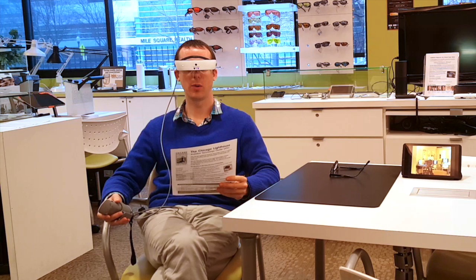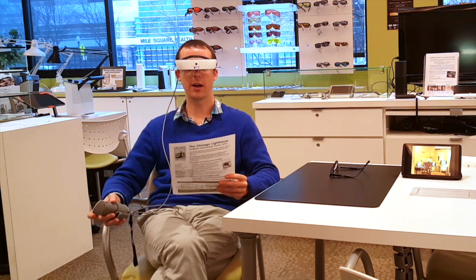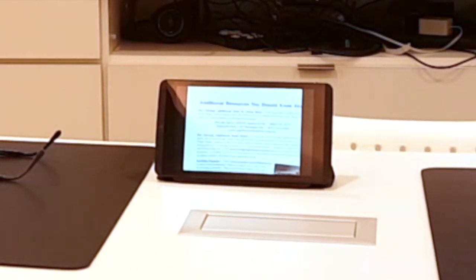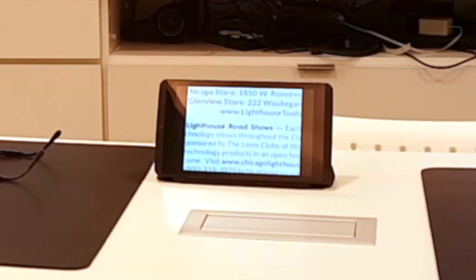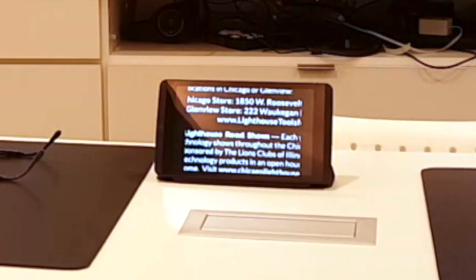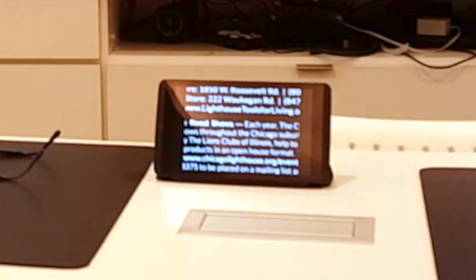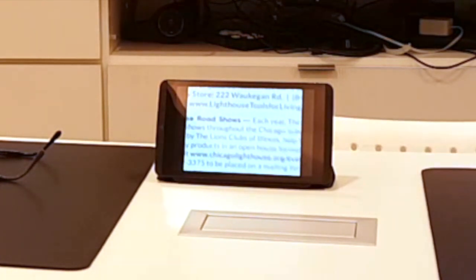Now I'm going to look at how the device fares when looking at something up close. I've got a flyer in my hand with a bunch of text on it. The device should automatically focus and I'll be able to magnify it and change colors for better contrast. The image is being streamed to the tablet on the left so you can follow along. At 4x magnification I can change the colors — very nice black on white, then white on black, which a lot of people like. I'm noticing the clarity is much better than the previous eSight model. We also have black on yellow, blue on white, blue on yellow, and then back to regular color — fantastic for reading.